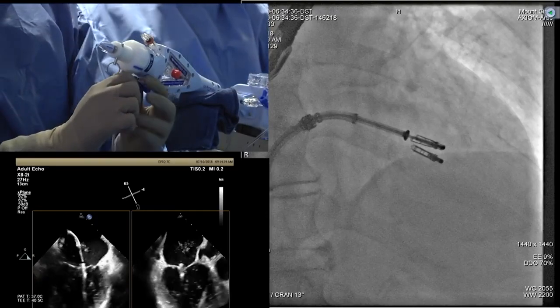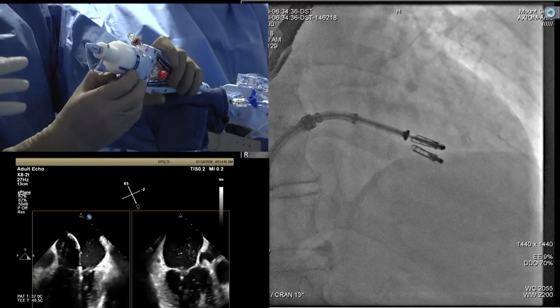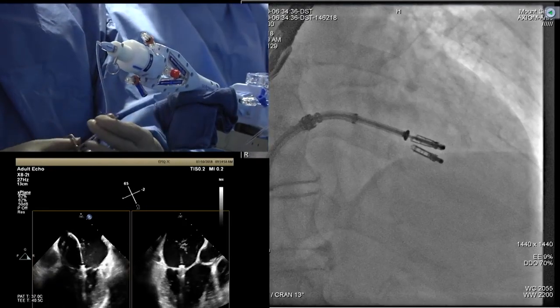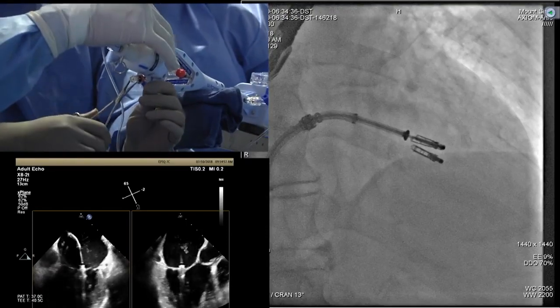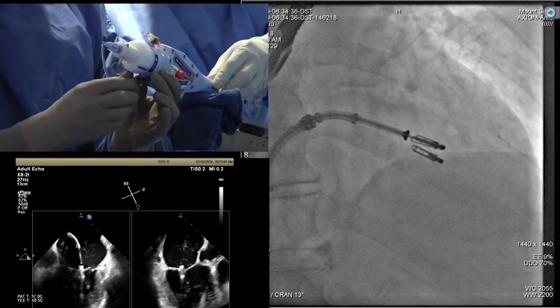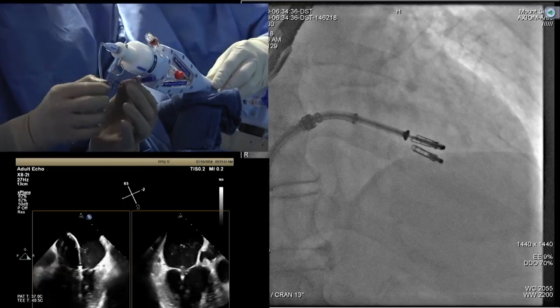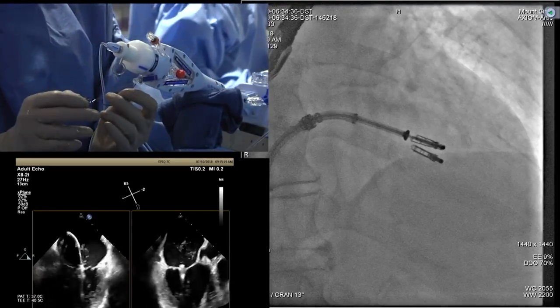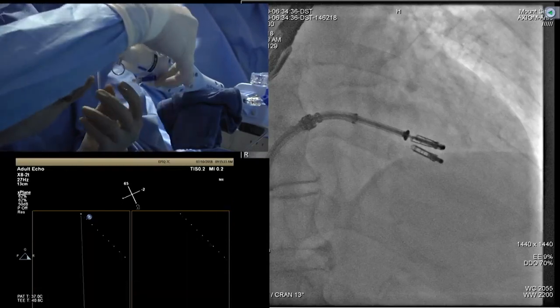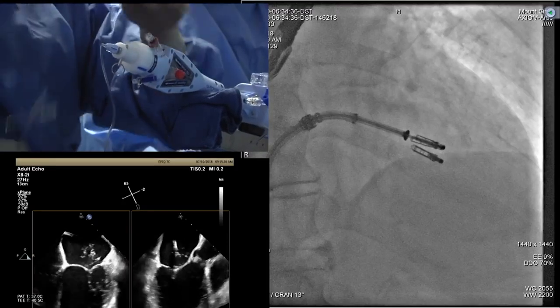Taking out the lock line of the clip. It is closed. Okay, we're taking out the gripper line, same. Too much water, guys. Don't need a fountain. Same gripper line. Yes, smooth and nice, coming out. Now we'll release the lock line. Tight.